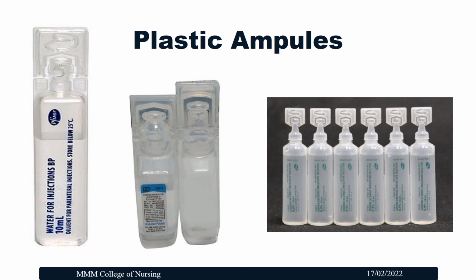Plastic ampules are also used to fill sterile medications or sterile water. They can be opened very easily by twisting the head of the ampule. We can then load the medication.